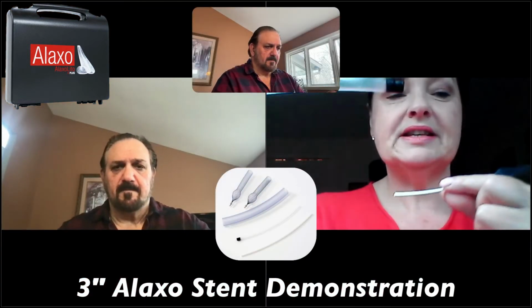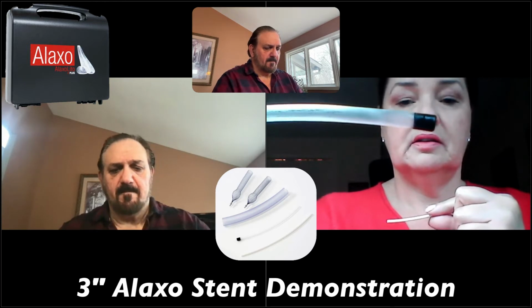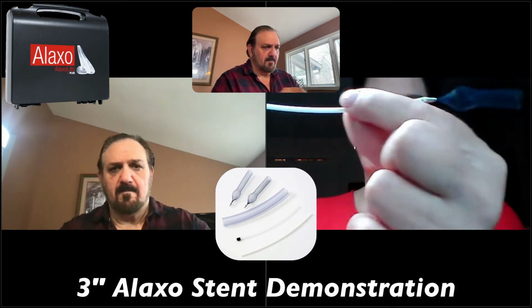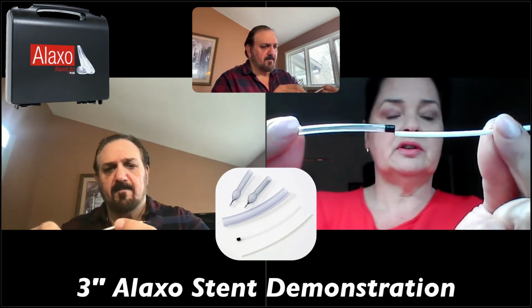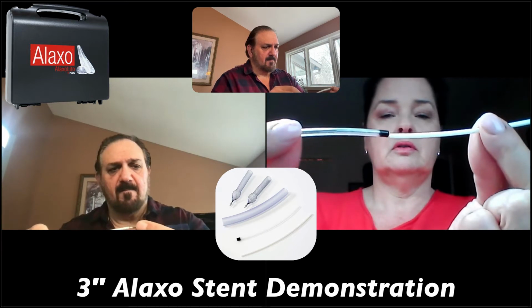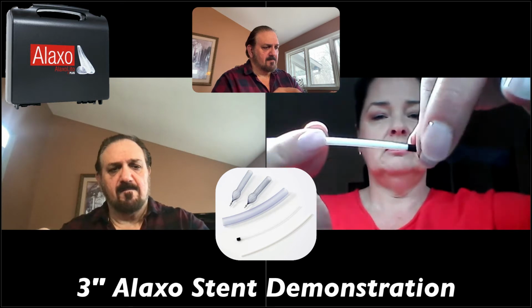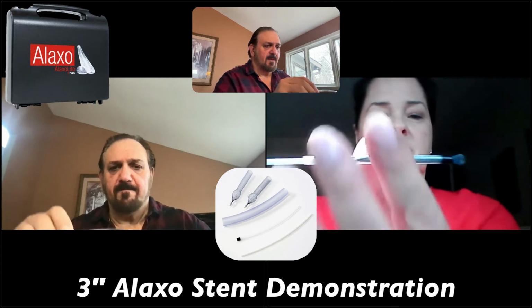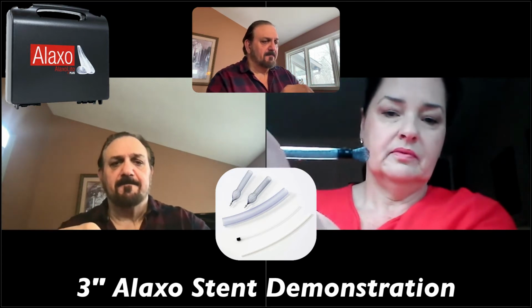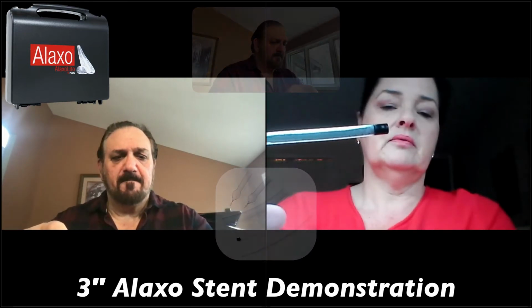Then you're going to take the introduction tube, which is this piece here with the little black end. The idea is that you're going to take your rod like this, with your stent, and take the introduction tube this way, all the way down, so that it encloses and collapses the stent. You want it just inside, and not poking out the end there.